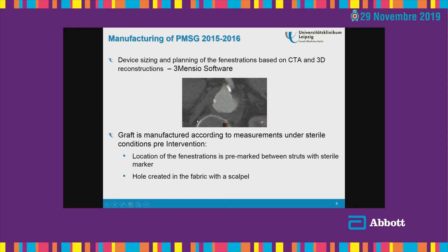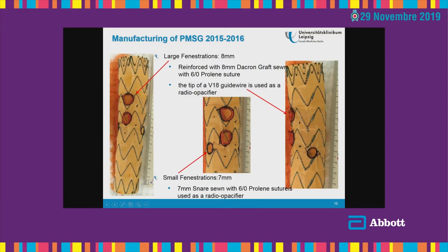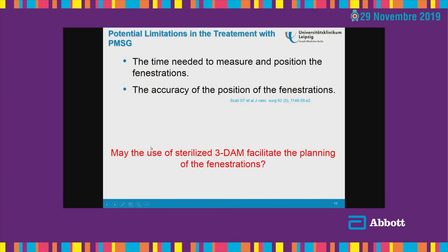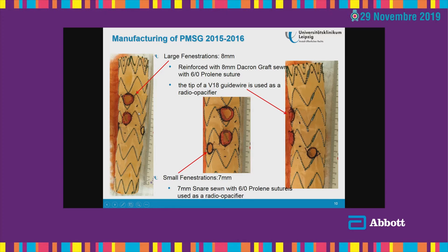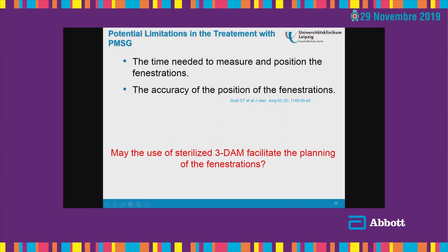We started this procedure in 2015. In the first two years, we had difficulties measuring the devices and planning the procedures, because we had the 3D measurement software available, but the accuracy was not always perfect. Here is the first graft — you can see on the big stent graft the points I placed to mark the fenestration. It took almost half an hour to place the fenestration, and then we sewed our markers and sewed up the grafts. But it took a long time, and we were thinking: is there another method to improve this planning?